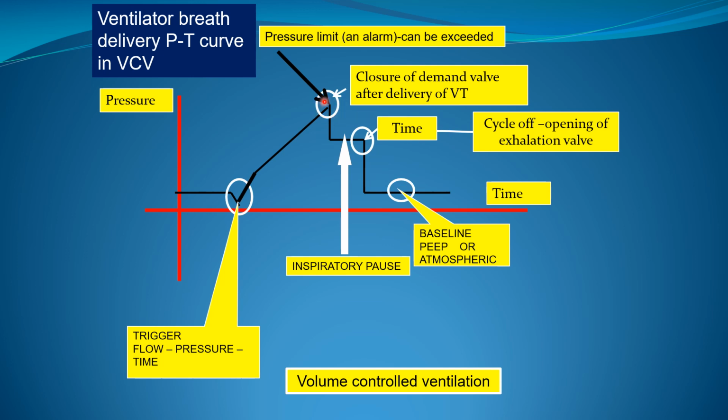When the flow is zero, this means that pressure resistance is zero, and we are left only with the pressure elastance, which is the plateau pressure. This pressure elastance, which is the pressure in the alveoli, equals the tidal volume over the total compliance.